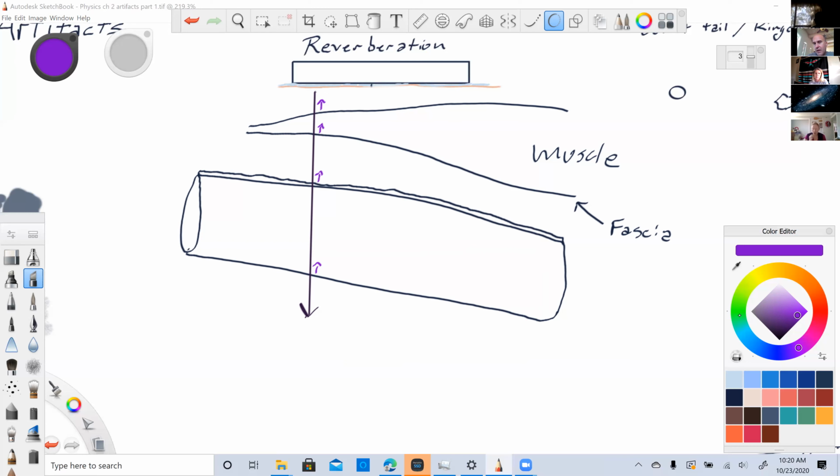But some of the things that could also happen is, you could have some portion of the beam come down to the wall here, which is a pretty echogenic wall, reflect back, reflect down, and reflect all the way back. Some portion of the beam, not the whole beam, but some small percentage of the beam is going to actually do this. So let's think about that.